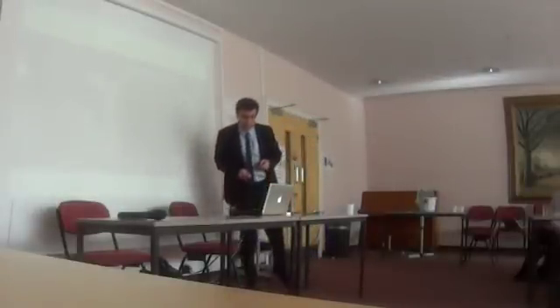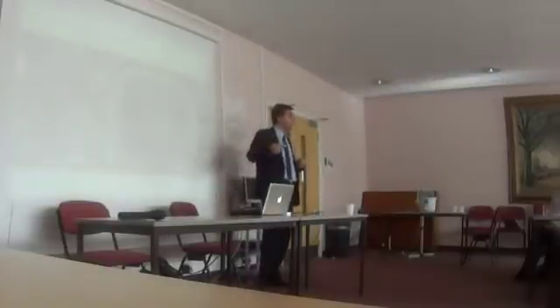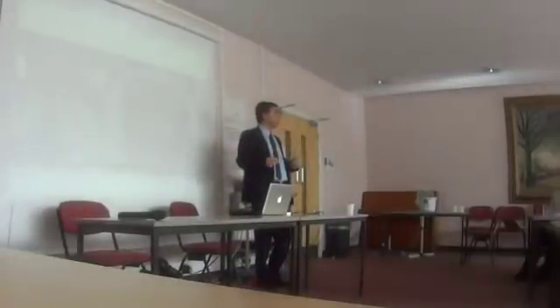So when we apply the gadolinium, which is looking at the scar, we didn't see any scar. So we can risk stratify this. Look, we didn't find any scar. He's got hypertrophy, so he has a low risk. Why don't we start with the pacemaker, rate control, and see how it goes.